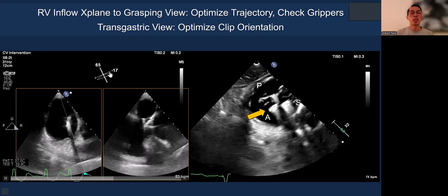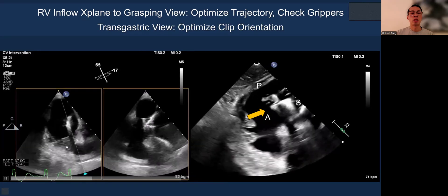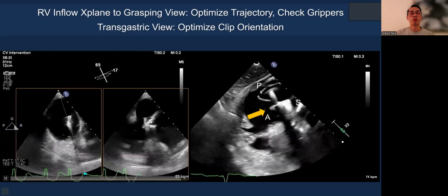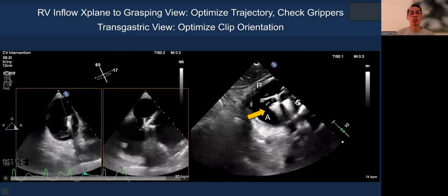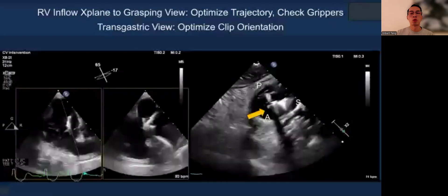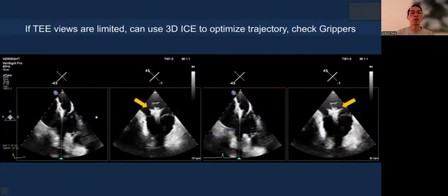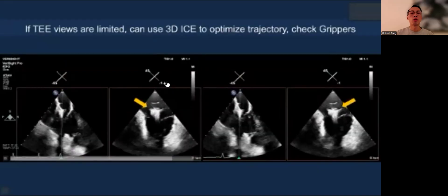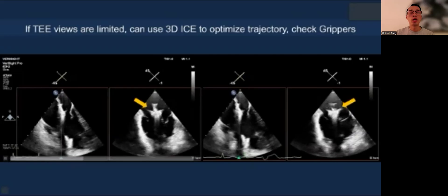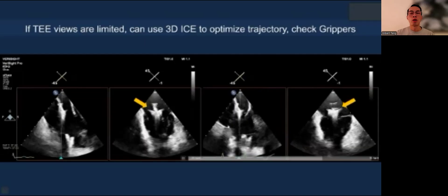On the left side of the image you can see the RV inflow view — the clip is perpendicular to the grasping view, the trajectory looks very favorable, and it's perpendicular to the tricuspid annulus. On the transgastric view on the right side, you can see the clip orientation being optimized once you cross. If you have trouble with TEE, you can use 3D ICE with the same workflow and working views — including checking gripper orientation and position on 3D ICE.